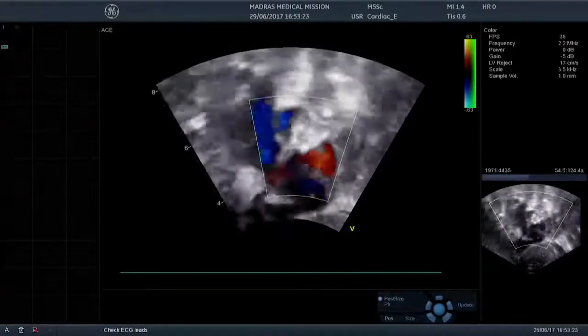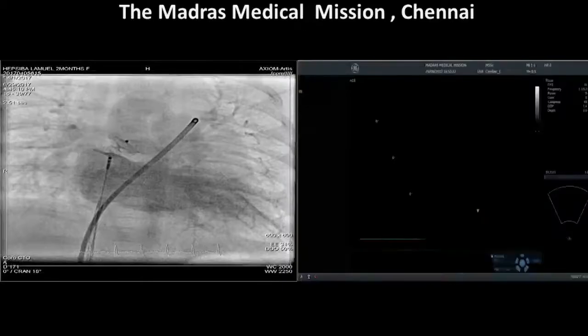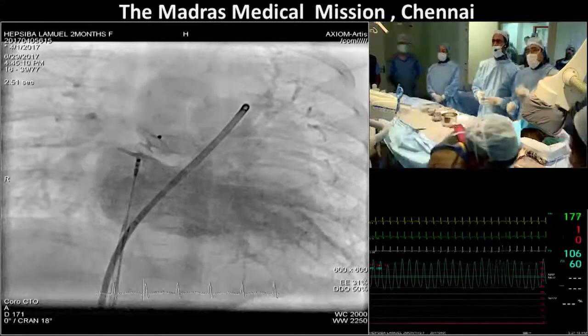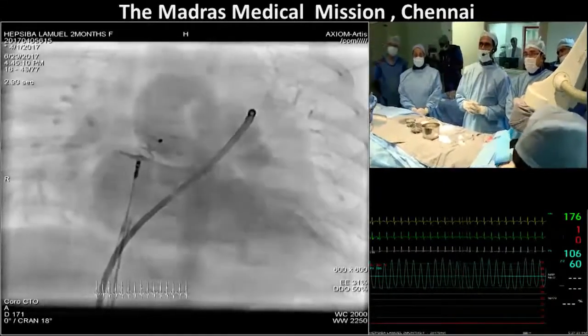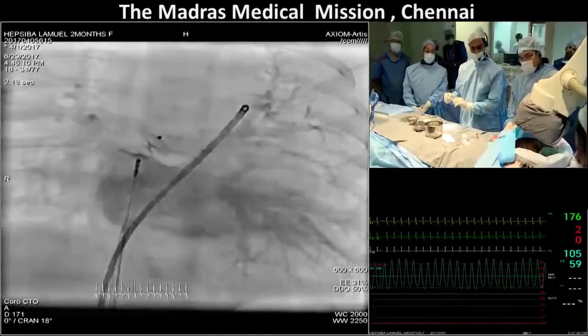I can release the... Is there a possibility that the right lower pulmonary vein is being interfered with by the device? Can you show us the levo phase again of that injection? Show that injection again. Pulmonary artery side is perfect. You don't have to worry about that at all. The only thing you have to worry about is the left. That looks pretty good. I agree.